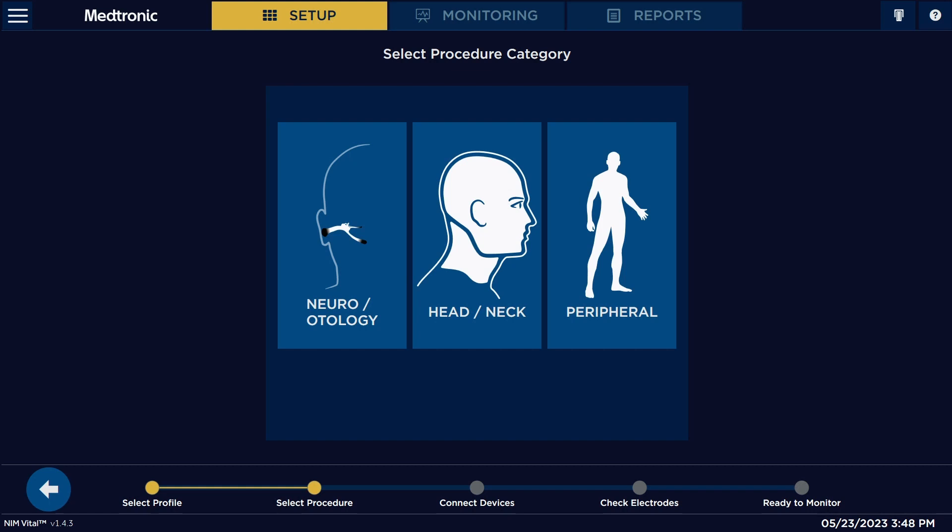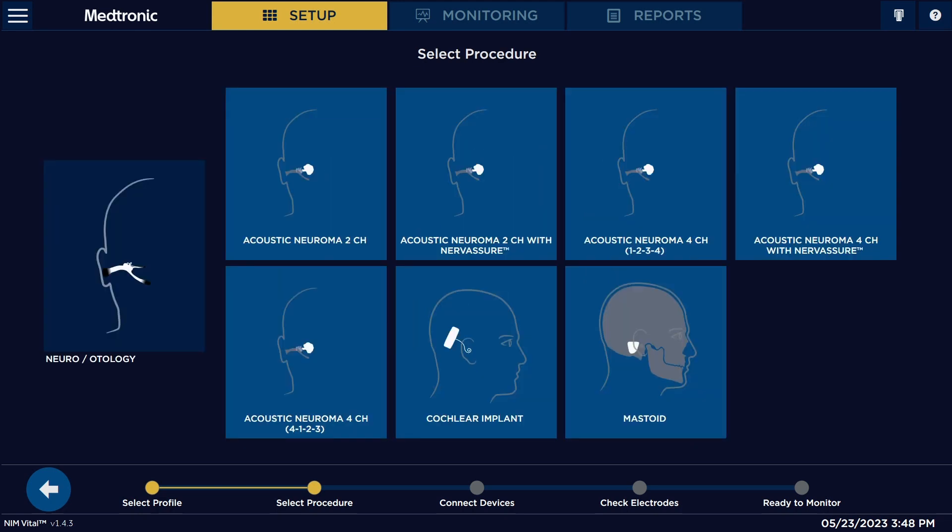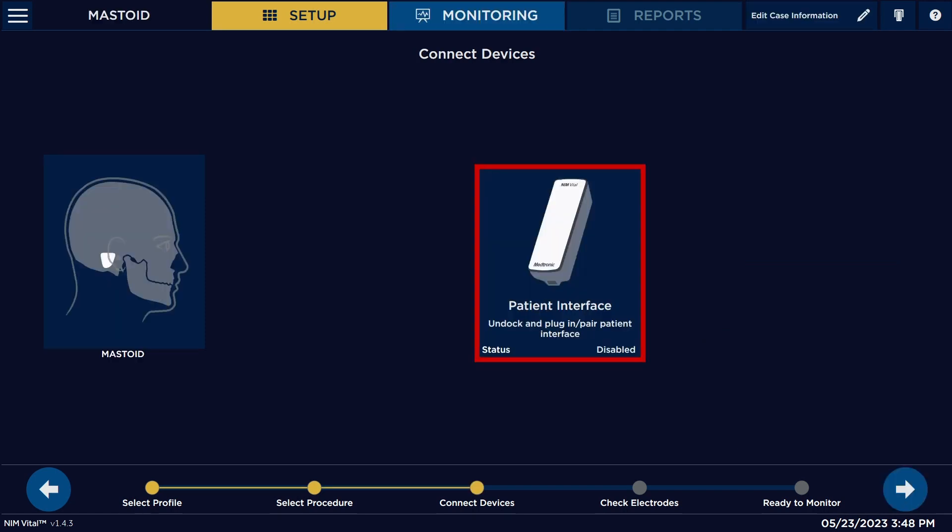Here we're going to be talking about a mastoid. Mastoid is under neurootology, so we're going to select neurootology. We're going to look for our procedure — here is mastoid — and we'll select mastoid.